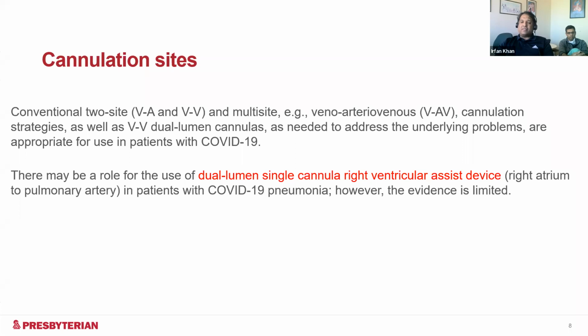So again, this has been a little challenging at our center to offer them without any consequence. Then there's these VV dual lumen cannulas. The question is, if you place them too early, the problem we've had is that these patients end up needing higher flows, and we've not been able to offer that with the dual lumen cannulas. Again, these patients also end up having liver congestion, and they've had issues with late RV failures. Again, this is something that we're going to look into the studies and see how we could do things differently.